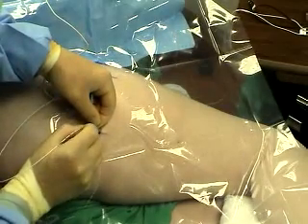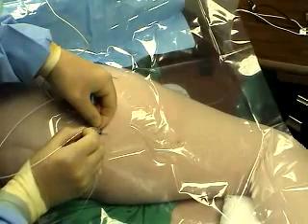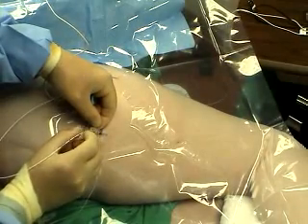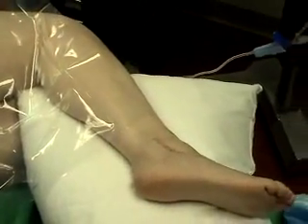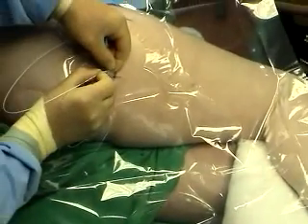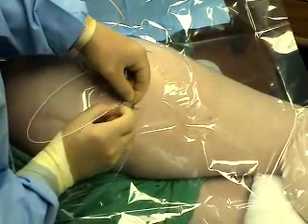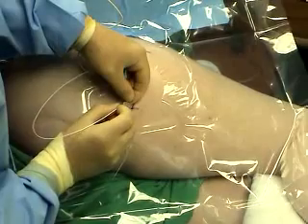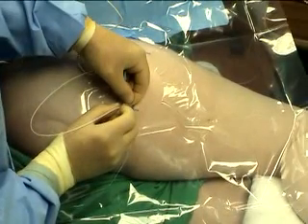The proximal end of the stimulating catheter is now attached to the nerve stimulator. This part of the catheter is placed in the palm of the left hand. The catheter tip is then placed into the shaft of the needle, and the muscle twitches should remain brisk and unchanged. Note that the broad black mark on the catheter indicates that the catheter tip is situated at the tip of the needle, but it is not yet protruding from the needle tip. The needle should never be manipulated if this complete broad black mark is not visible.